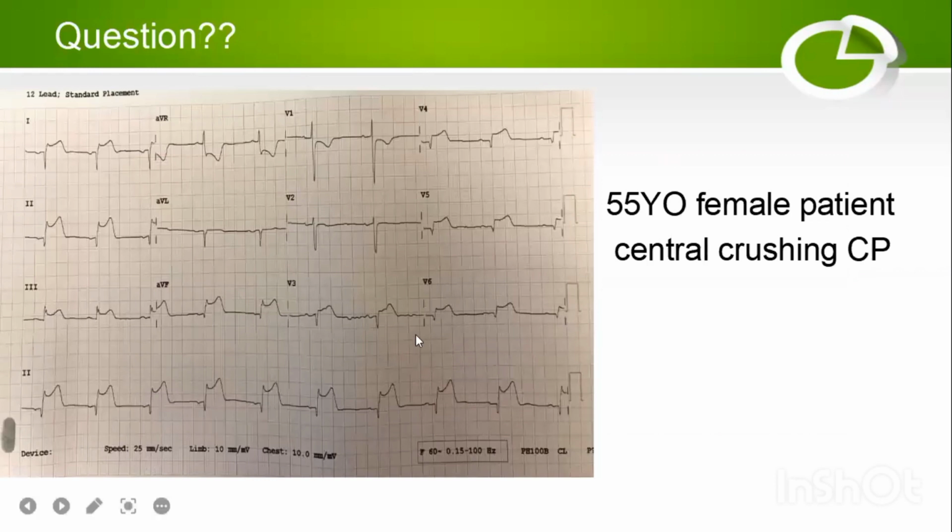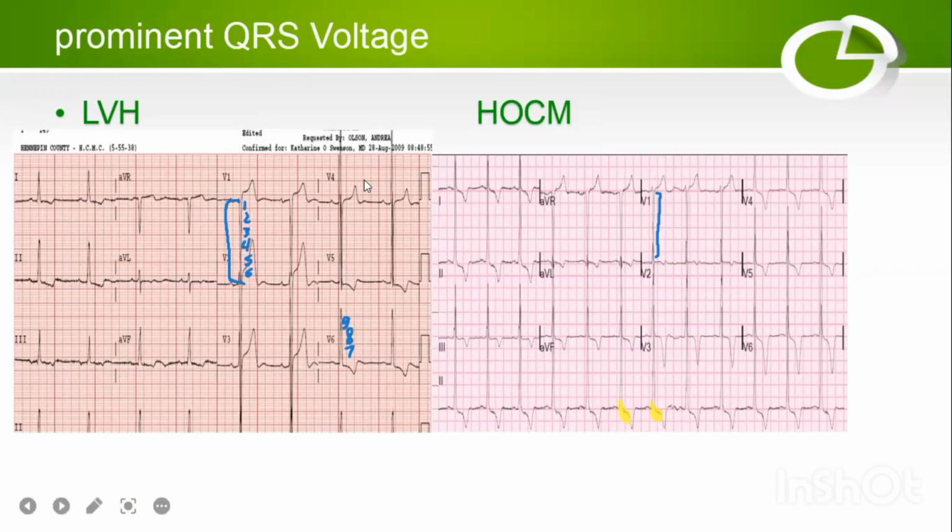Please, can you repeat HOCM? Yes, HOCM is associated with younger mortality. What are the criteria in the ECG? Dominant S wave in V1 and R wave in V6.